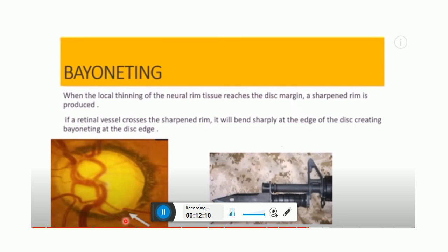Bayonetting is characterized by double angulation of a blood vessel. With neuroretinal rim loss, a vessel entering the disc from the retina may angle sharply backward into the disc and then turn towards its original direction to run across the lamina cribrosa. This occurs when the thinning of the neuroretinal tissue reaches the disc margin, then a sharp rim is produced. When the blood vessel crosses this sharp rim, it will bend sharply at the edge of the disc, creating bayonetting at the disc margin.